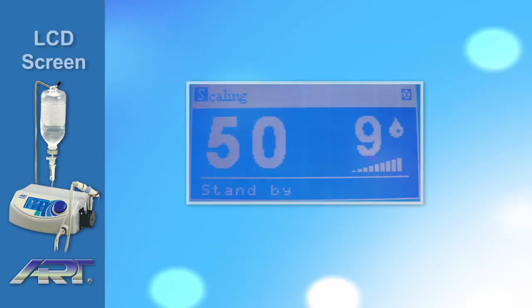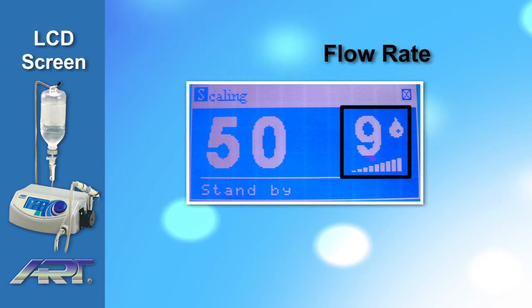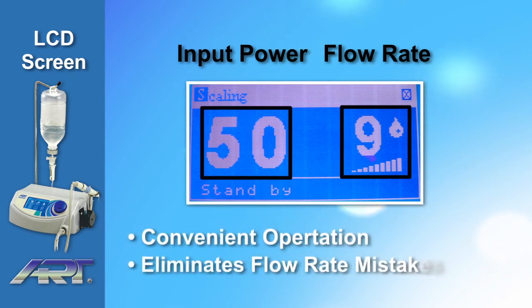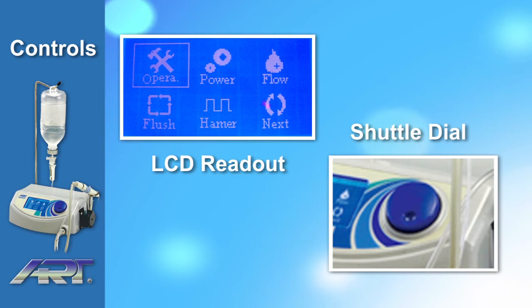The large LCD screen displays the percentage of water used in relation to input power, and the flow rate automatically adjusts according to the power setting. This allows for convenient operating and eliminates the possibility of setting the wrong flow rate. All system functions can be activated from the control interface LCD touchscreen and shuttle dial.